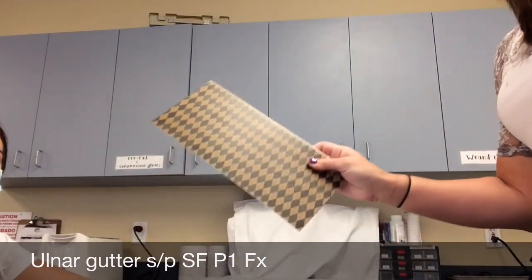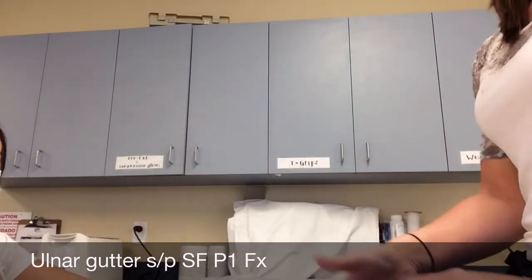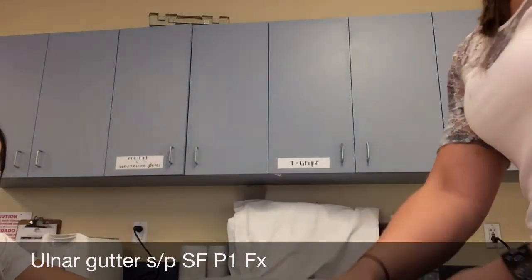This orthosis is called a hand-based ulnar gutter and was fabricated for a small finger P1 fracture after surgery.